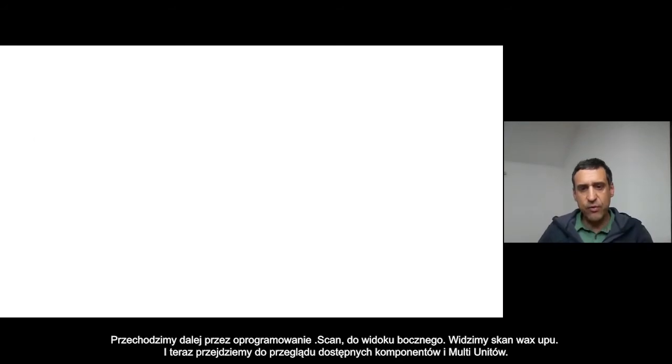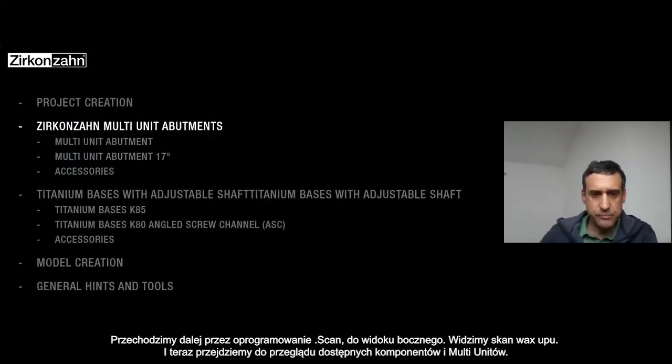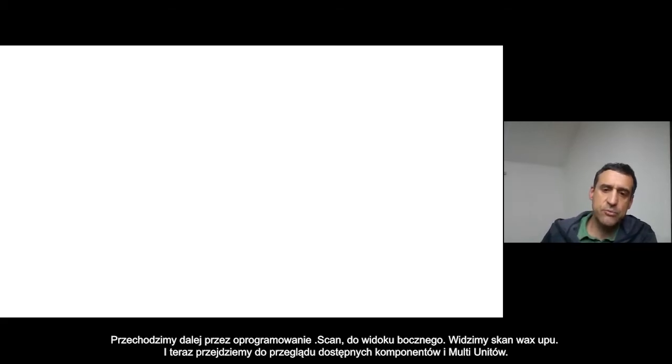From the lateral view you can see our wax-up. Now we make an overview about some components and some multi-units.